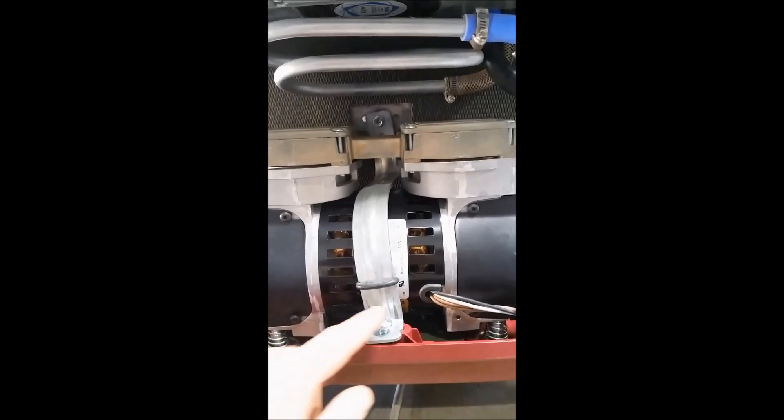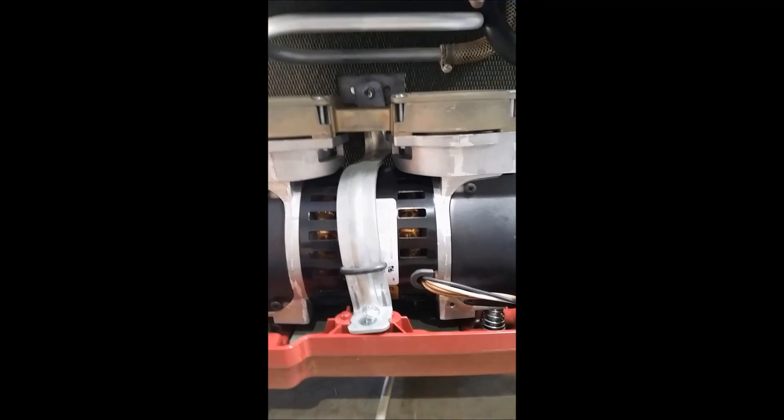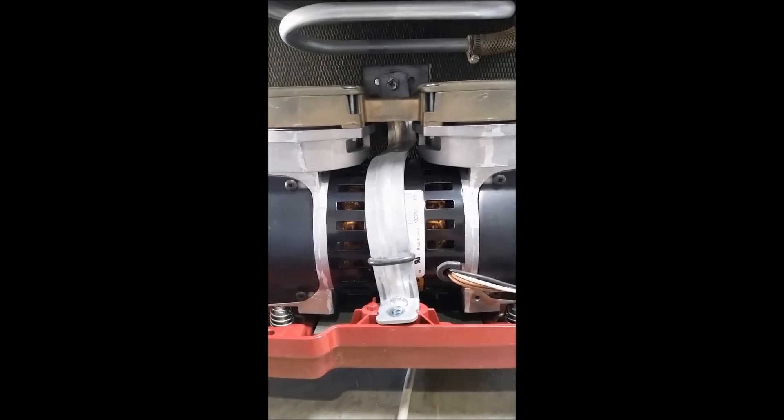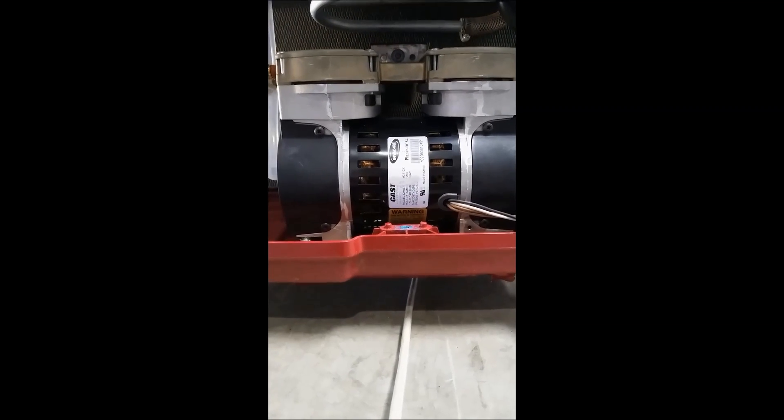The first thing you're going to do is remove these screws here and back here. This will allow you to get the compressor free from the housing. We've now removed the screws and you can see that the little lever comes right off.